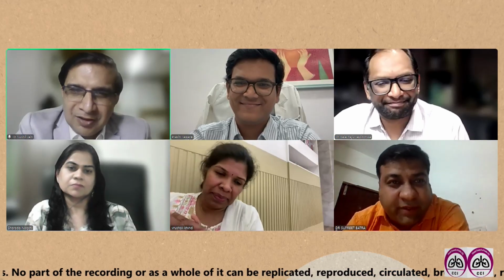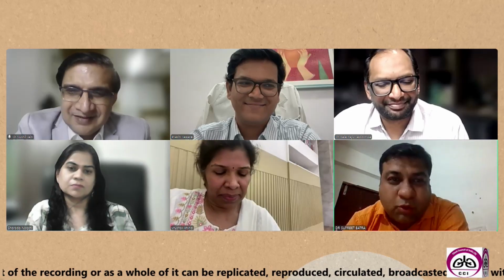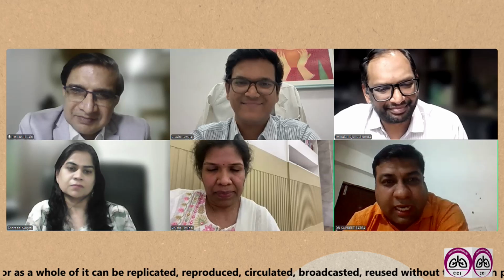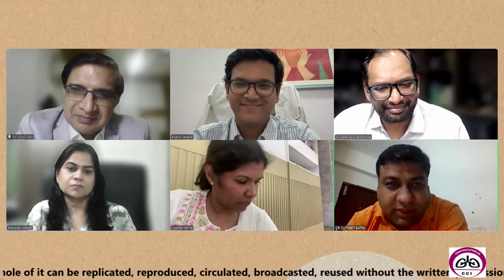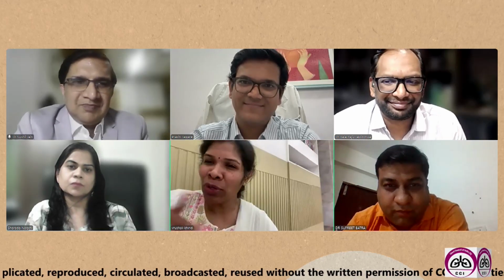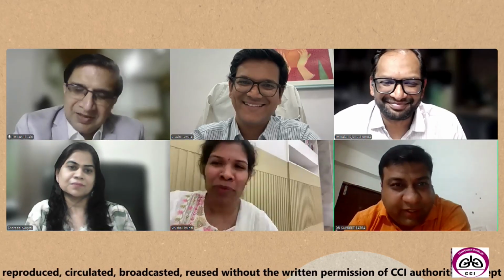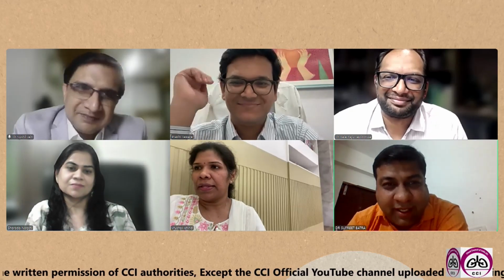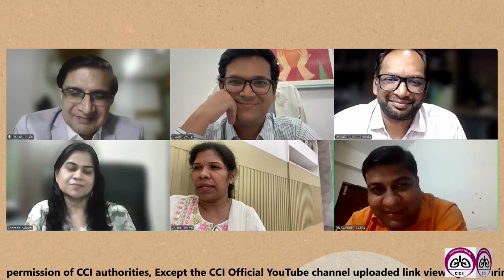Yes. And similarly for EBUS also, we map the node and discuss the probability with the radiologist, and then after sampling, we discuss with the pathologist also. So he's more focused on that. And you give feedback to the radiologist that this is what it is. You have to make them your friends. You have to be working together. For every ILD, anything like that, we discuss with radiologists and pathologists, which is of utmost importance.